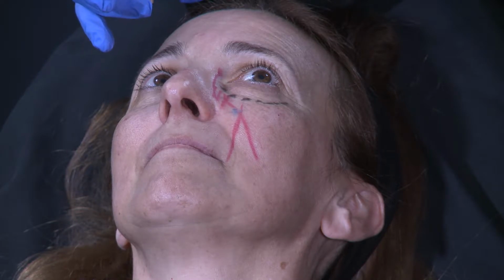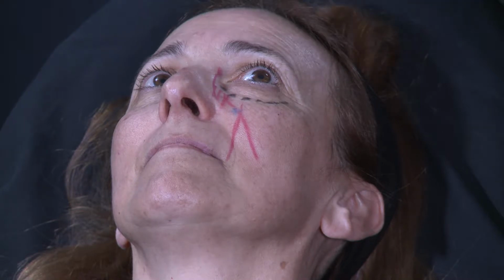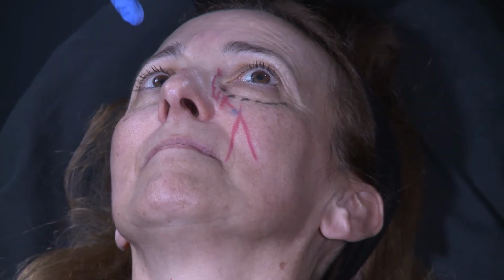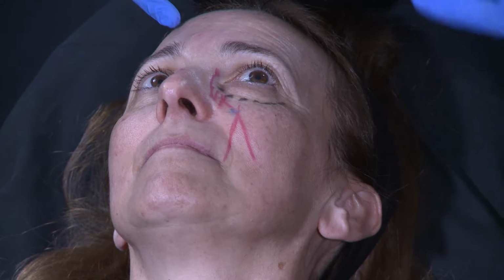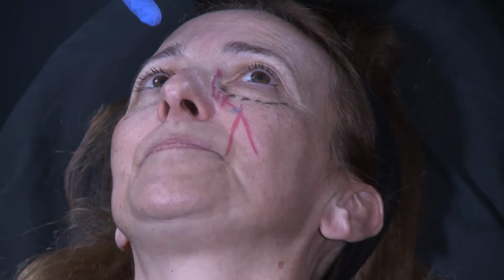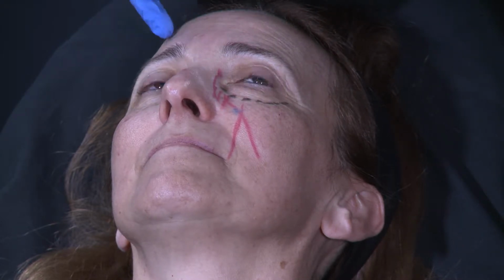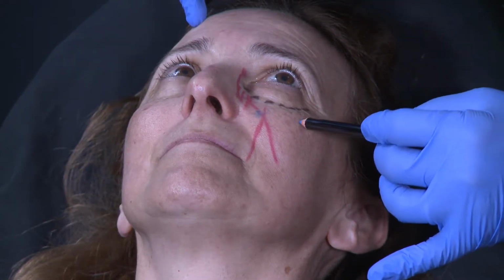It's around 40 to 42 millimeters. And the length of a needle you have in your blister, do you know what is the length? It's 13 millimeters. It means that if you want to treat the tear trough completely, you will have to do 3 punctures with your needle to erase your tear trough. It means 3 times more bleeding, 3 times more swelling, 3 times more danger to reach an anatomical landmark.